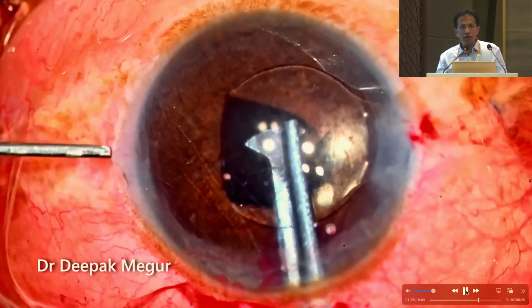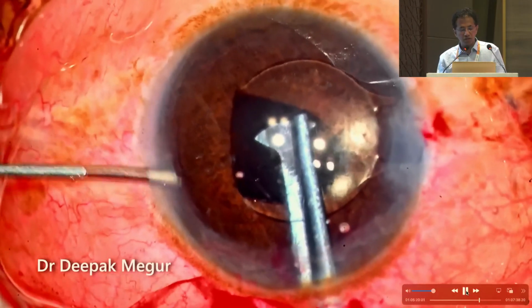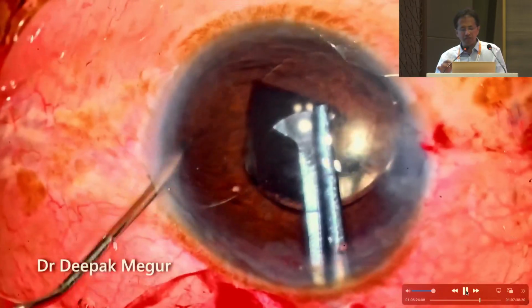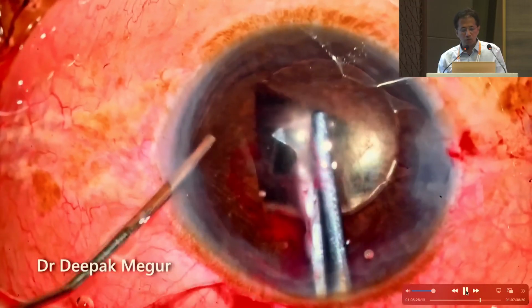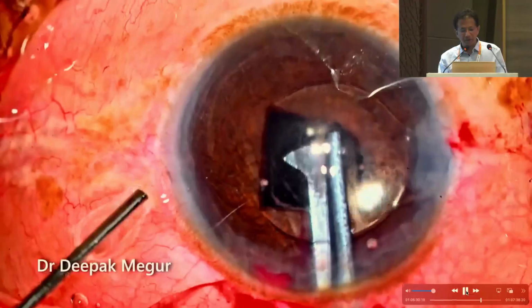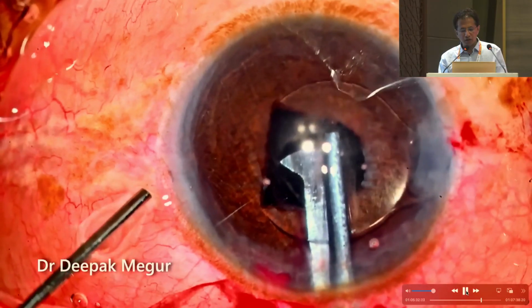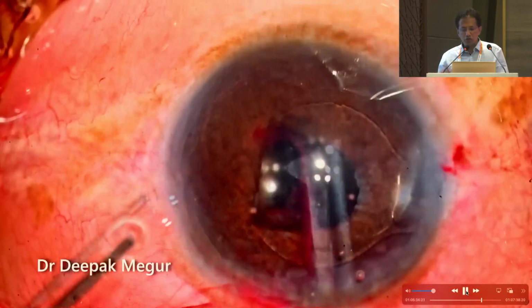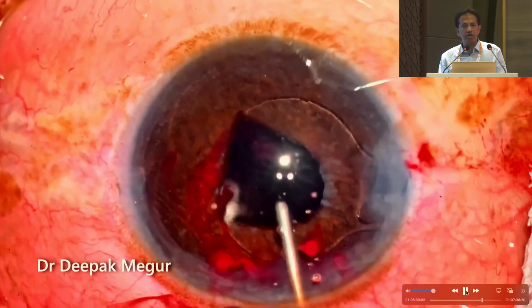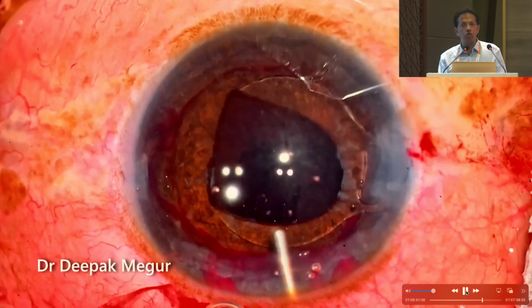So you know where your side port incisions are. Best would be to always mark them initially. You don't want to struggle to see where the side port is. Then just go in and press the iris down. You can see the knuckle there. And then, as I said, you try to move the lens a little bit so that you see that the iris is also moving along with it. That ensures that your enclavation is foolproof and you're not going to drop the lens back.